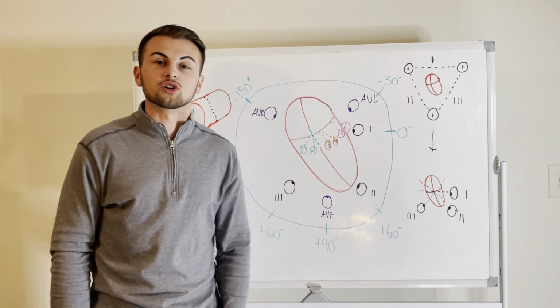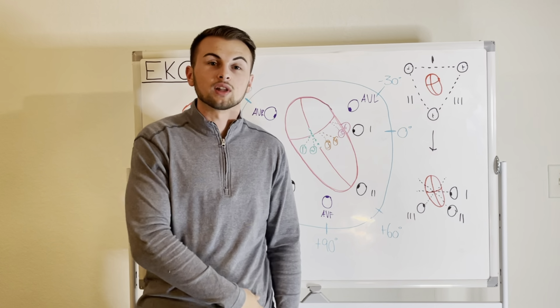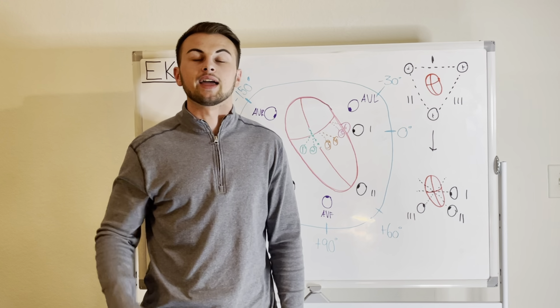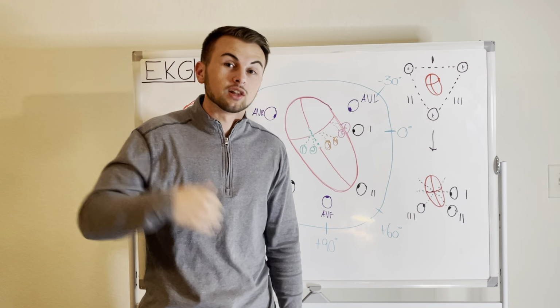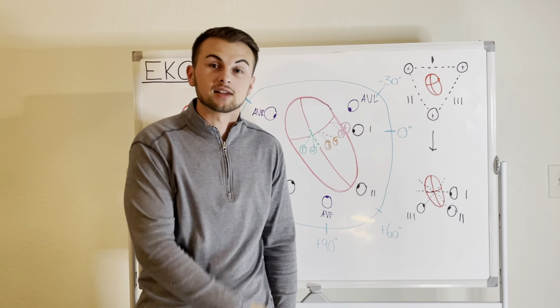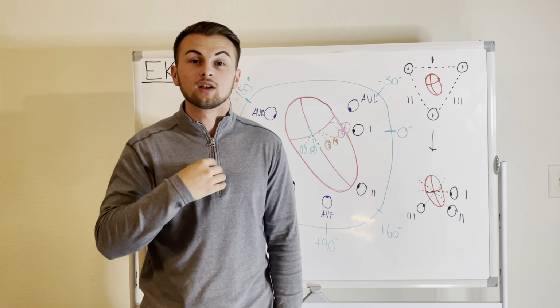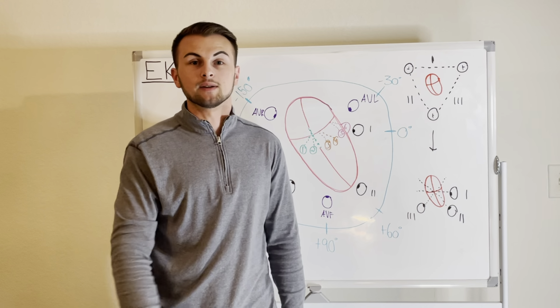Now, first we must learn a dance. It goes right left, right lower left, left down. Again, right left, right lower left, left down. Or negative positive, negative positive, negative positive. This helps us remember lead 1, lead 2, and lead 3.